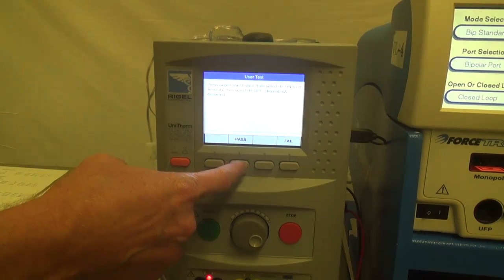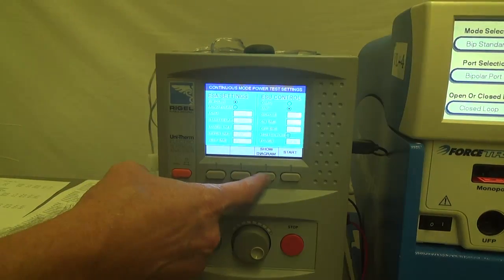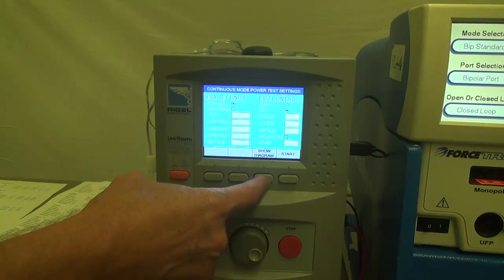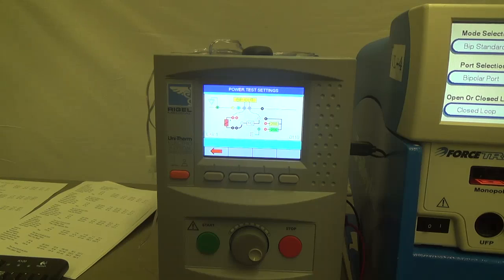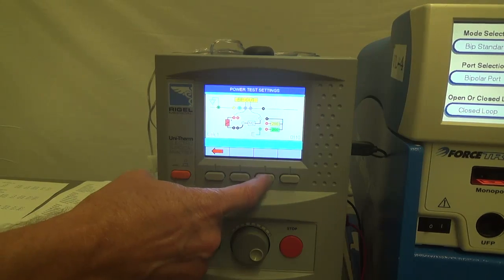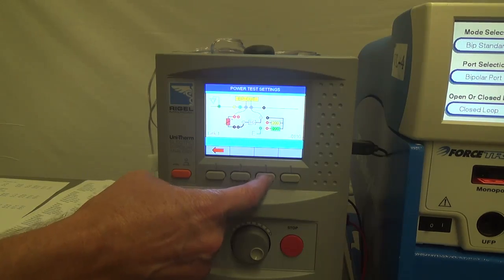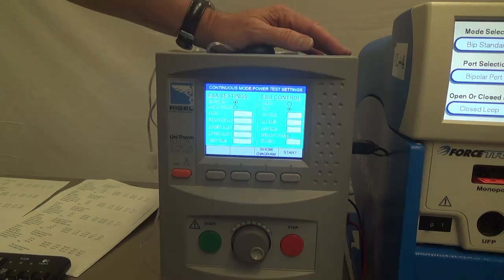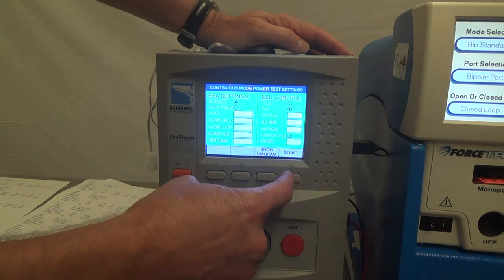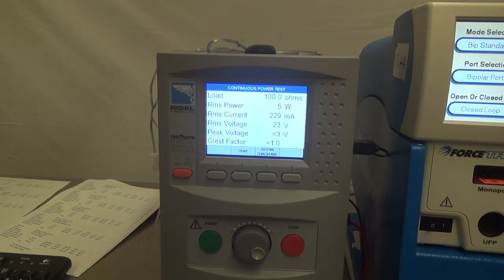This again gives you instructions on how to actually turn the machine on. Here we can show the diagram if you have never seen it and you want it. But again, this diagram doesn't change for any bipolar output test. So now, this is all we do. We press start 3 times. Start here, the green start button, and the start RF on the triad.